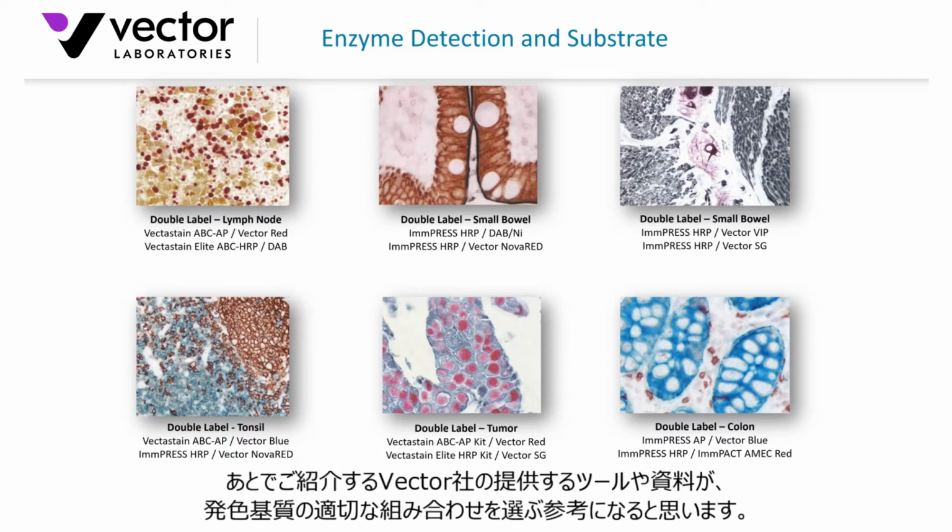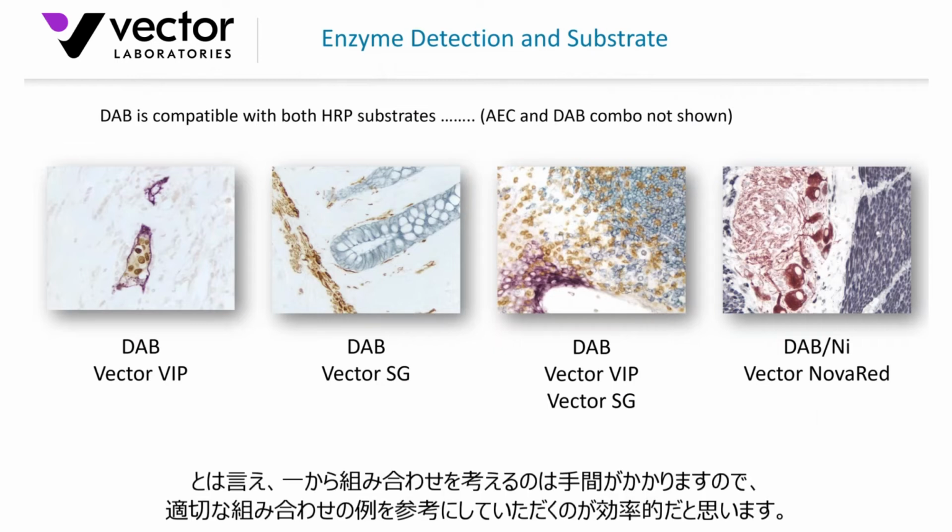So have a look at some of the tools and resources I'll show you a little later on here in the webinar. See what you think might look appropriate for your given application, and you can certainly apply those. But that sort of muddies the water a little bit, and is not particularly helpful to investigators looking to get into the application. And so what I've got here is an easy way to help eliminate some of that guesswork on what color combination might work for you.